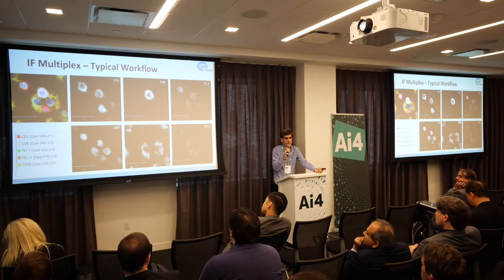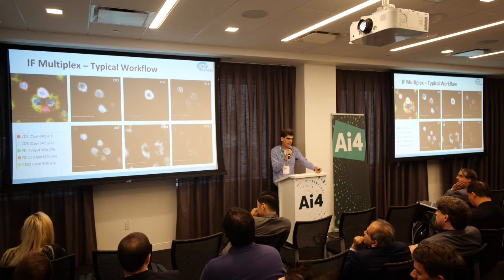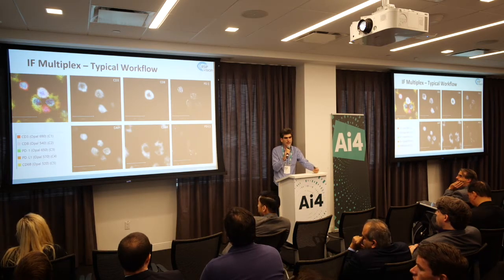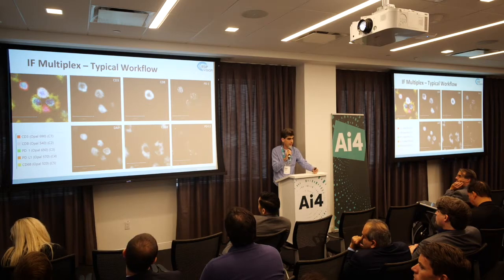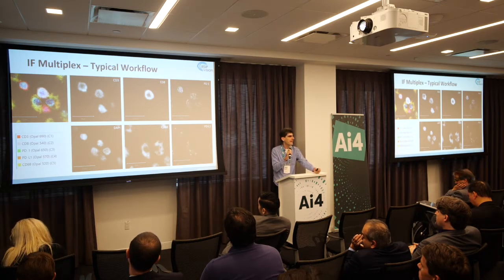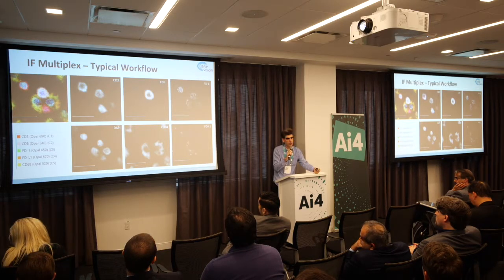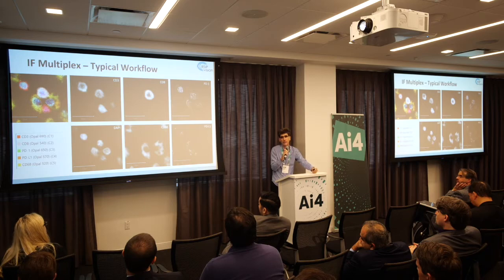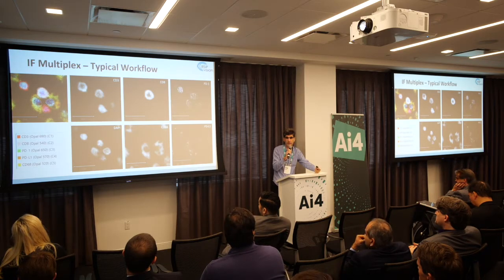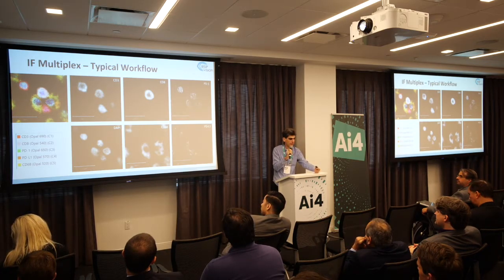In the past, the way this was done was by turning these intuitions of the domain knowledge expert into a set of rules. So you have a threshold in one channel, maybe an intensity, maybe a percentage, maybe some combination of both. You combine these channels and use it to classify these cells. If it's an easy case like that, then maybe a classical algorithm will work. Maybe you want to do better than that. You want to annotate it. It'll be easy to train your annotation team. In more subtle cases, they can still be annotated by a human, but rule-based systems are not going to work.